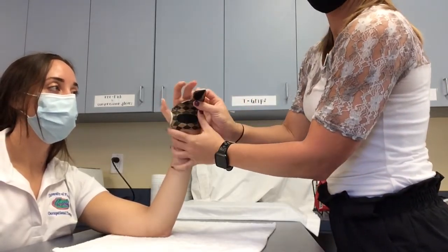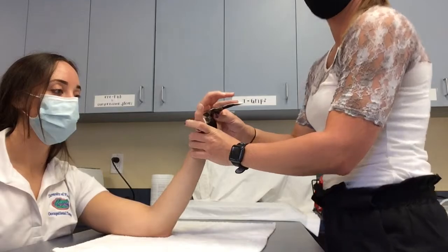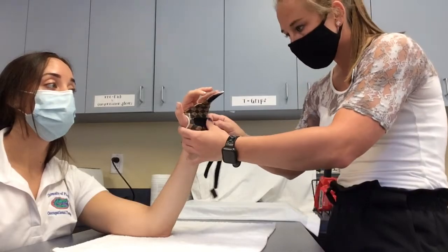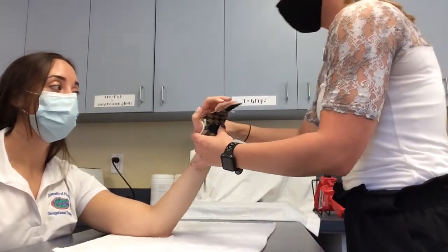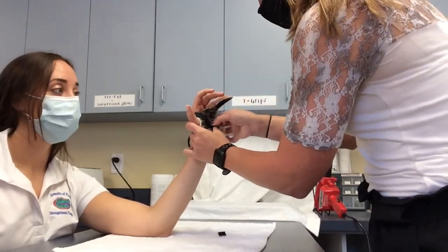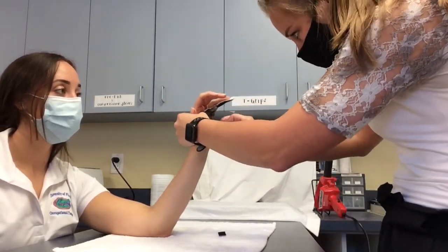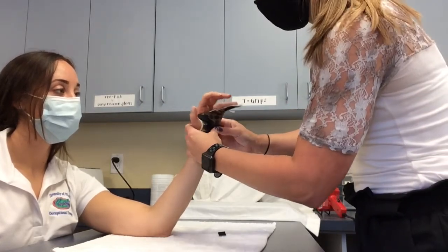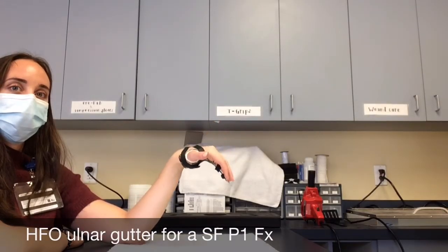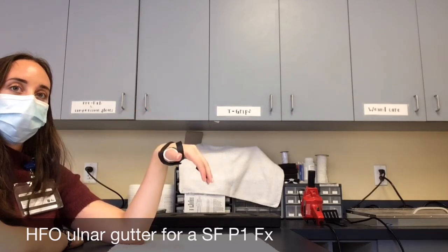Once you are finished securing the Velcro, place back onto your patient and begin to use the soft strapping to strap your patient in the orthosis. Use two straps for the ring finger and small finger. Depending on where the pins are, you want to place one right above the DIP joints and same with the PIP joints. I also chose to create a Y-strap to go through the web space and along the dorsal aspect to support the hand.